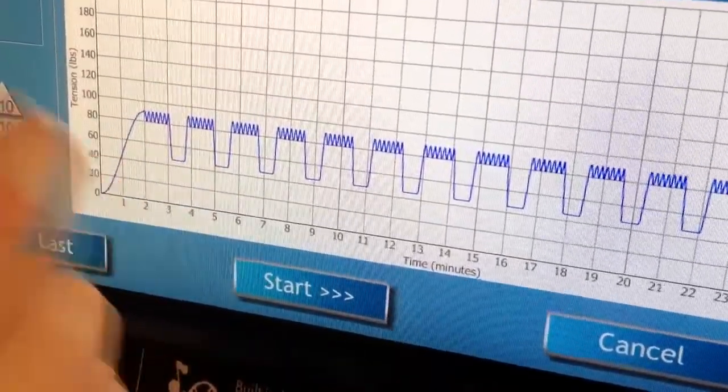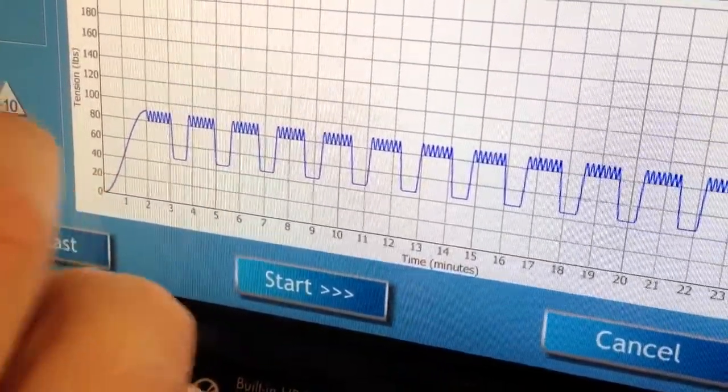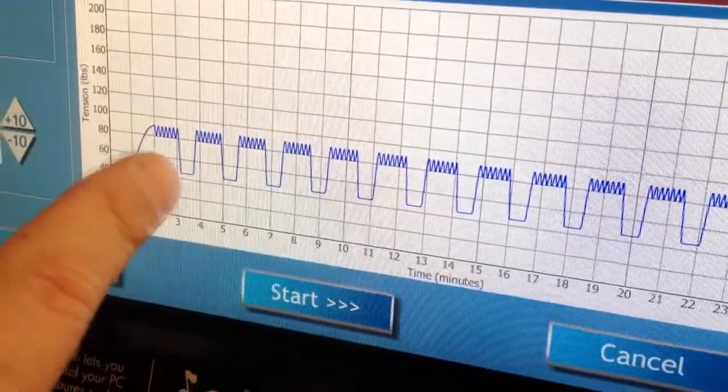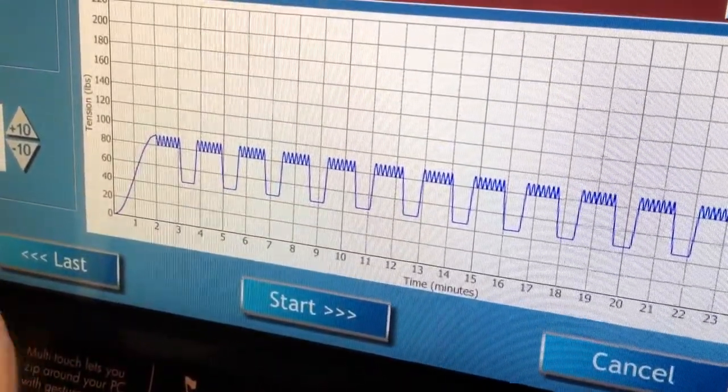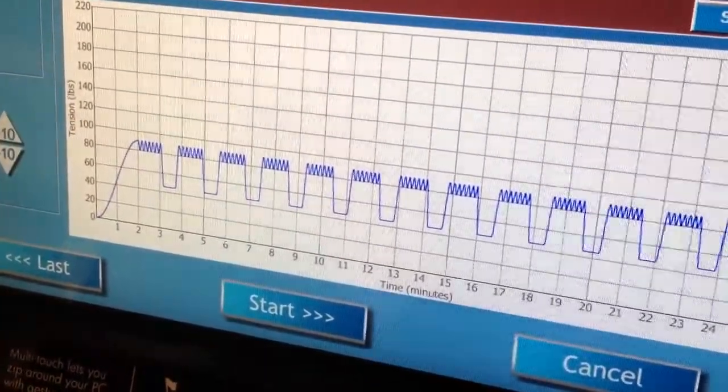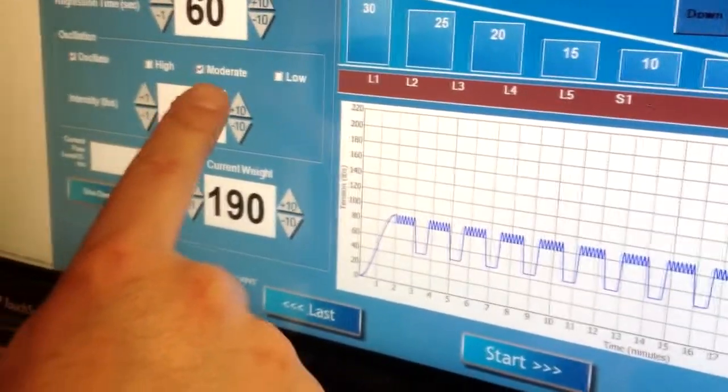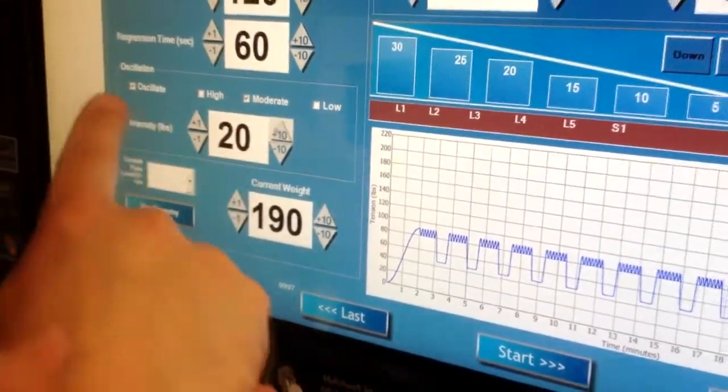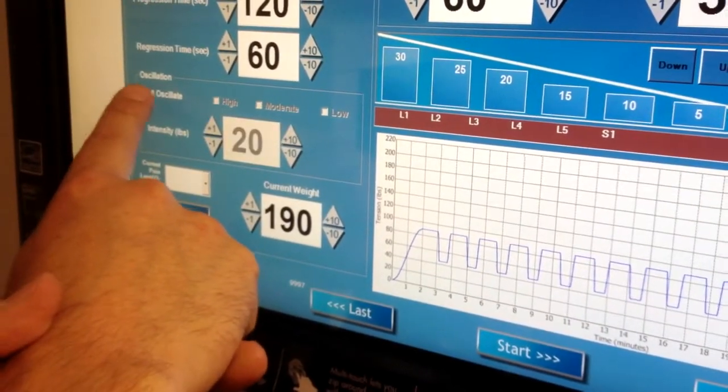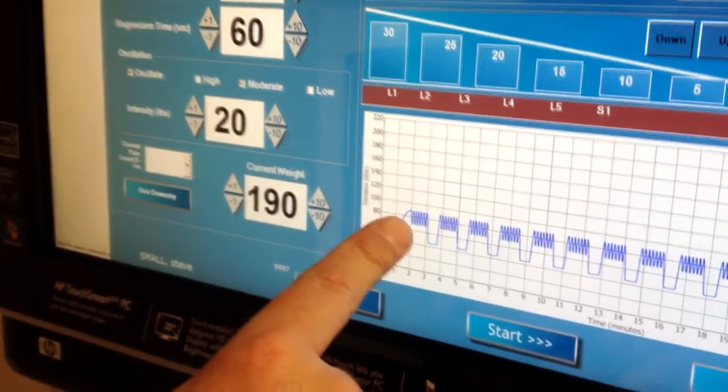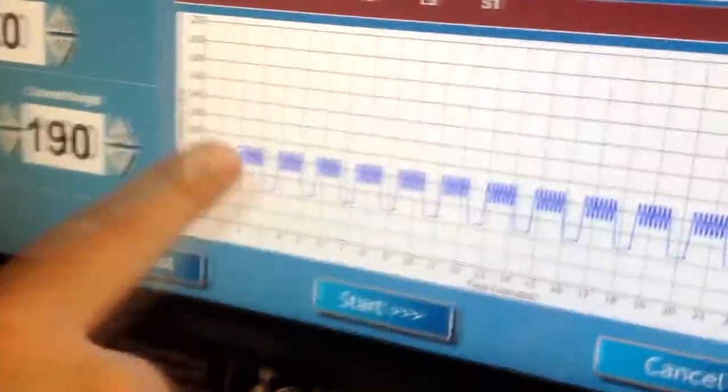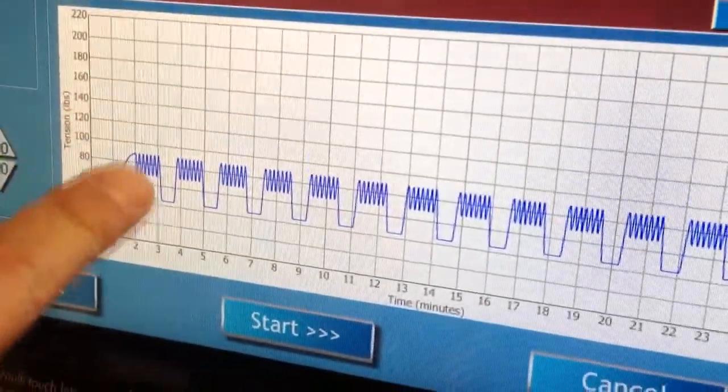What I wanted to look at was the possibility to increase the amplitude of that oscillation. And so over here we can adjust the intensity. So if I increase that intensity by 10 pounds, we can see here that we have a much greater degree of oscillation.